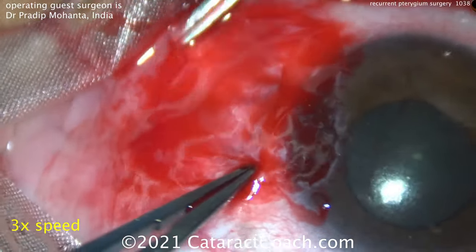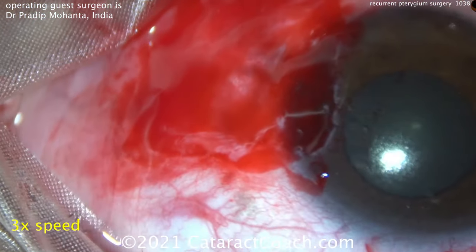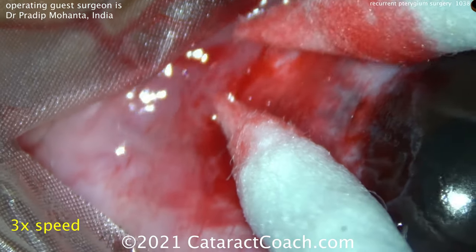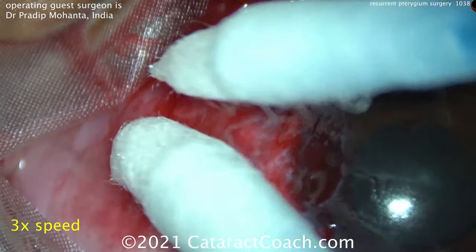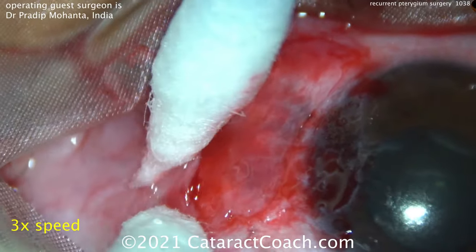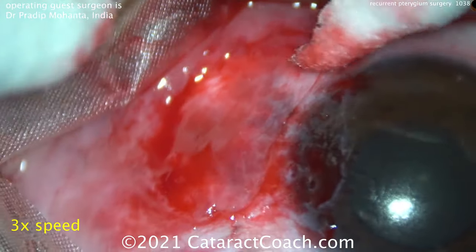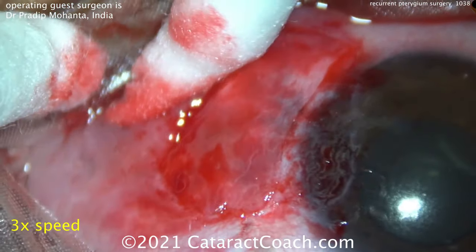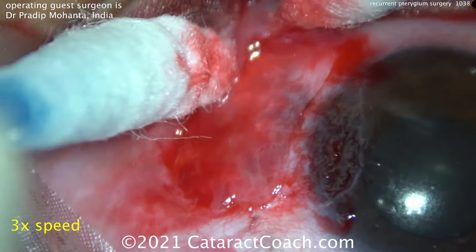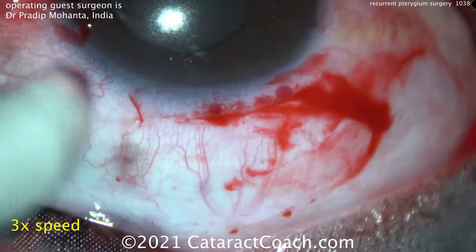Once he has that fresh blood, he quickly places the graft over it, sets it down, and he's going to use the natural fibrin and the natural clotting of the blood to hold the graft without sutures. Two cotton-tip swabs are used to roll any fluid or blood from behind the graft out. You can see the graft is not moving at all — you're just carefully squeegeeing out any fluid in that interface. You want just a little bit of that fresh blood there.